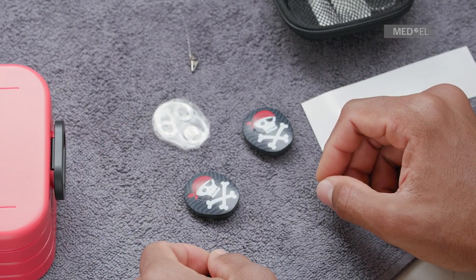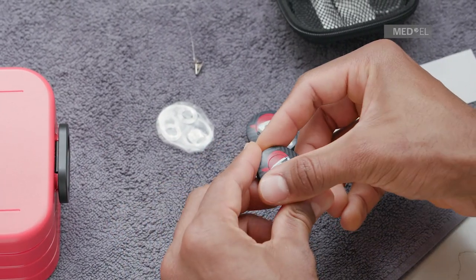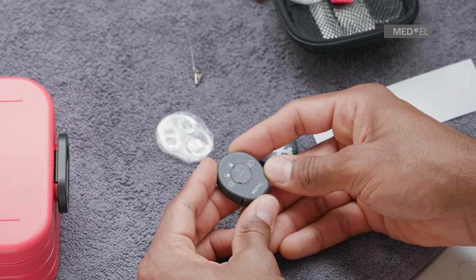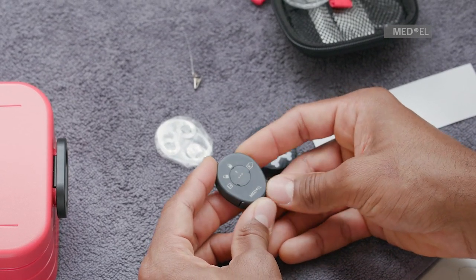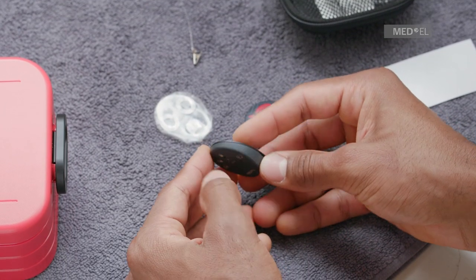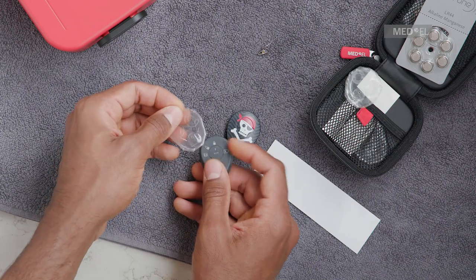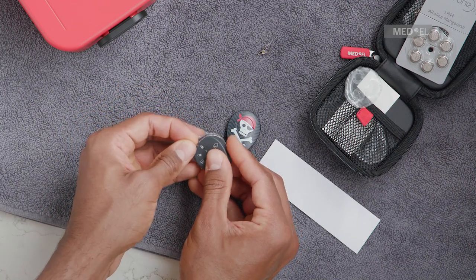Remove any attachment clips from your audio processor. Hold Samba 2 with the flat side facing upwards so that you can see the MED-EL logo. Insert Samba 2 into the skin by placing the end without the battery compartment into the side with the circular flap.